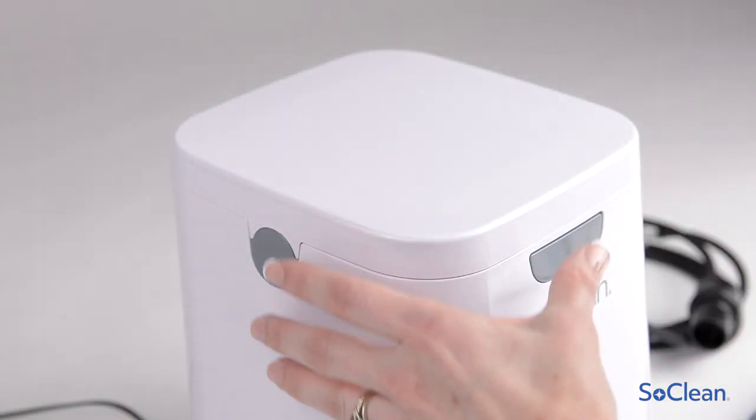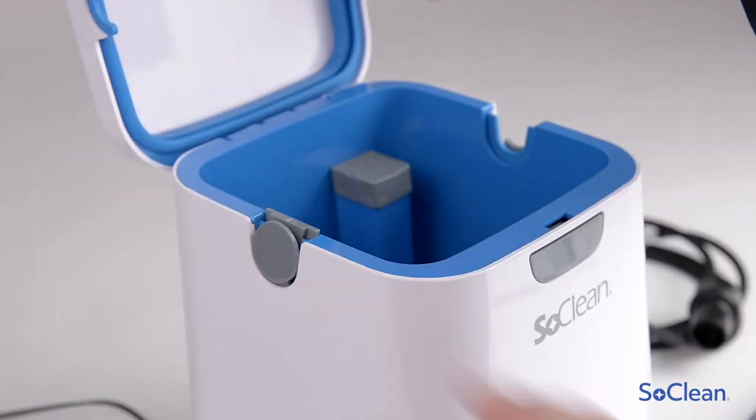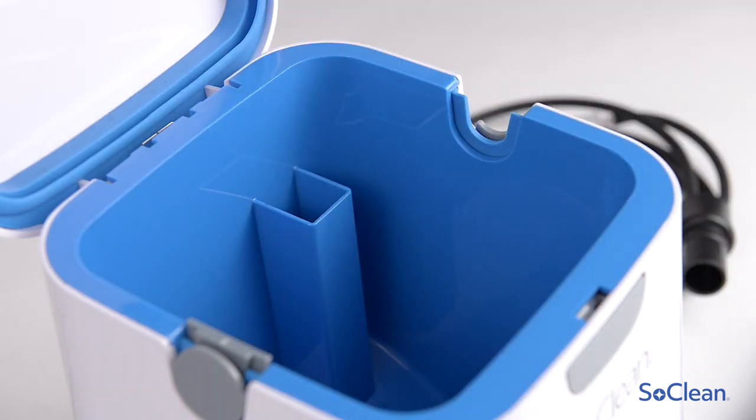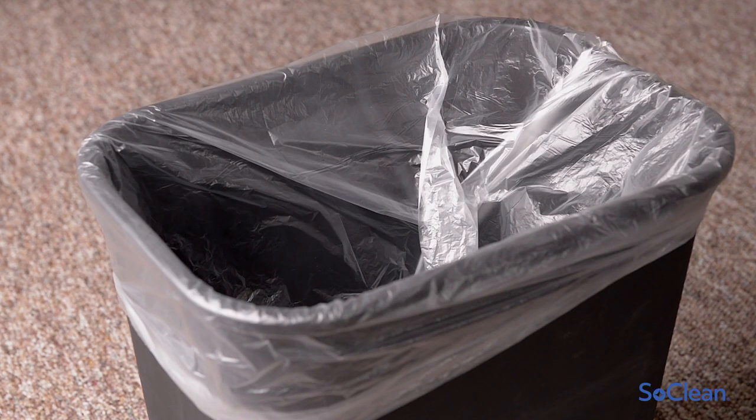Open the SoClean so that you can see inside of the chamber. Remove the old filter inside the SoClean by pulling the filter up and out. You can discard the old filter in the garbage.